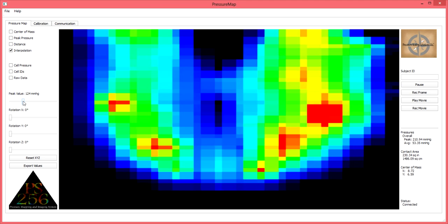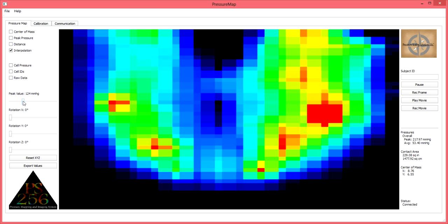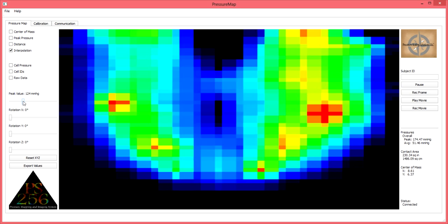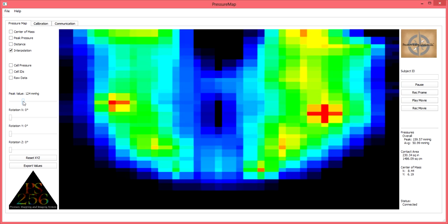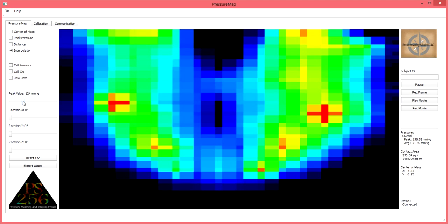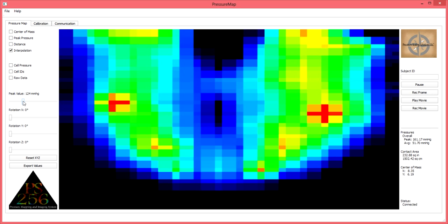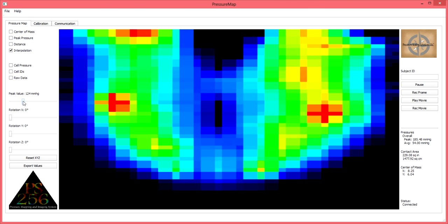Now when I have the peak value scale set at, for example, 124, I know that anything above 124 mmHg is going to be displayed in red. But I don't know if that red display is indicative of 125 mmHg or 300 mmHg.